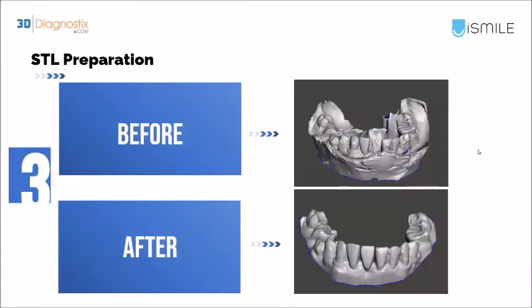We also, if we have spacing, for example, extracted tooth or an impacted tooth, if it's more than 3 millimeters, we can do one of two things, either replace a Pontic or an artificial tooth or a bar. In the anterior segments, from the canine to the canine, we prefer to add a Pontic or an artificial tooth for aesthetic reasons.